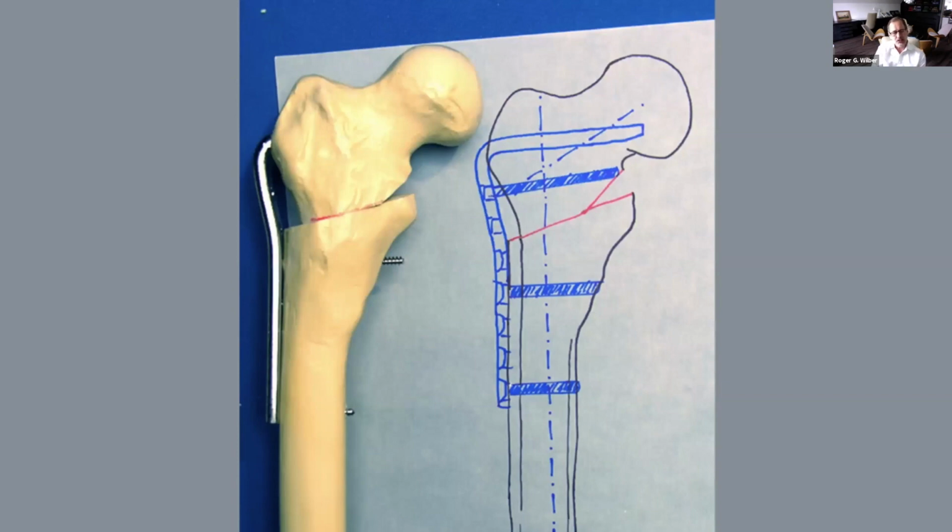And that technique's extremely important. It does vary a little bit from patient to patient and how soft their bone is, how hard their bone is. And you have to be careful about how big of a gap that you leave when you put that plate on the proximal segment.